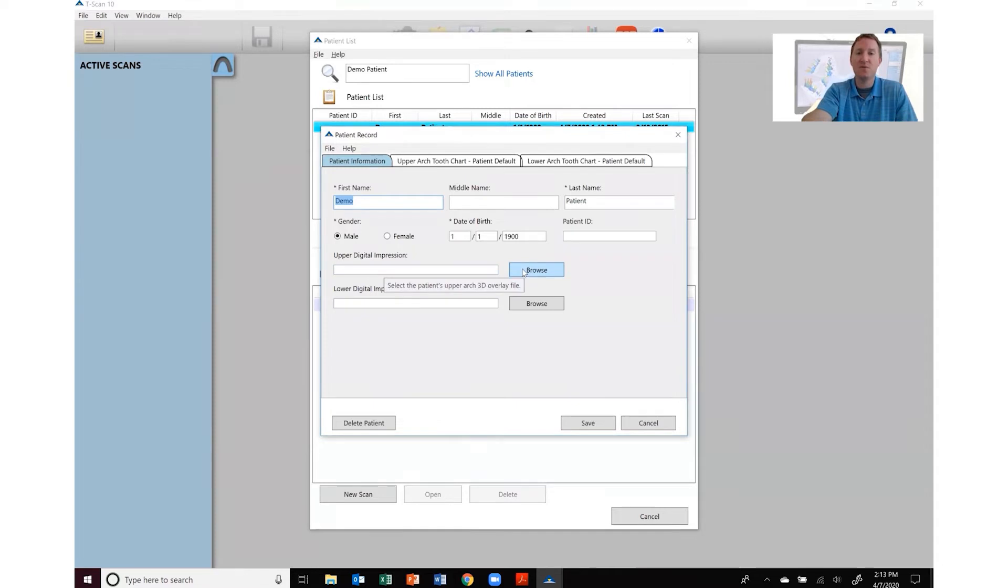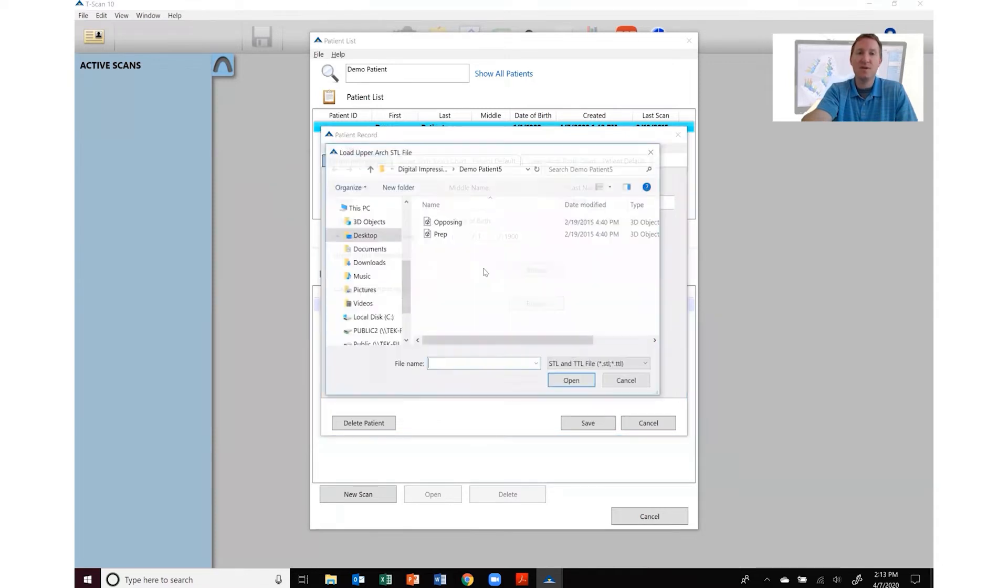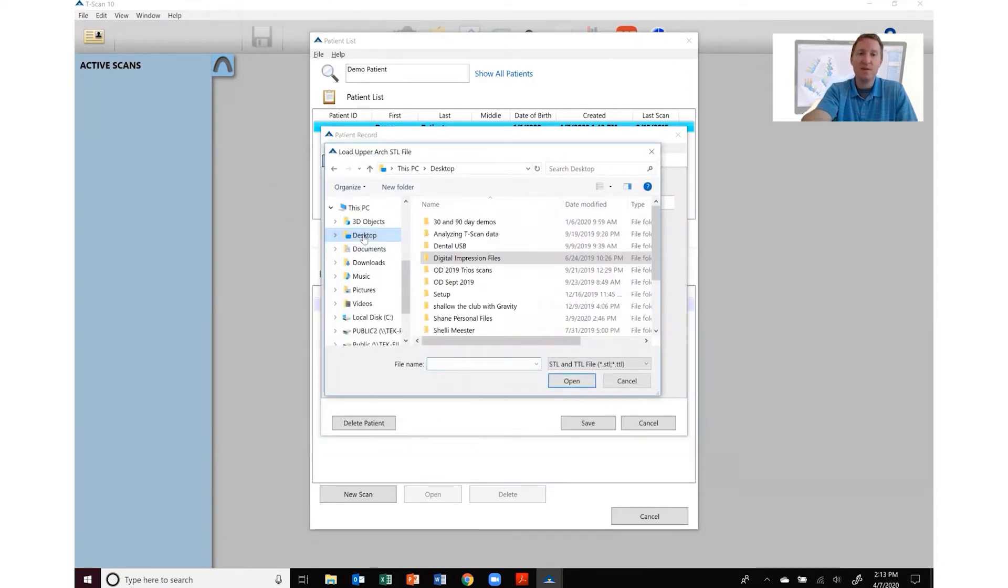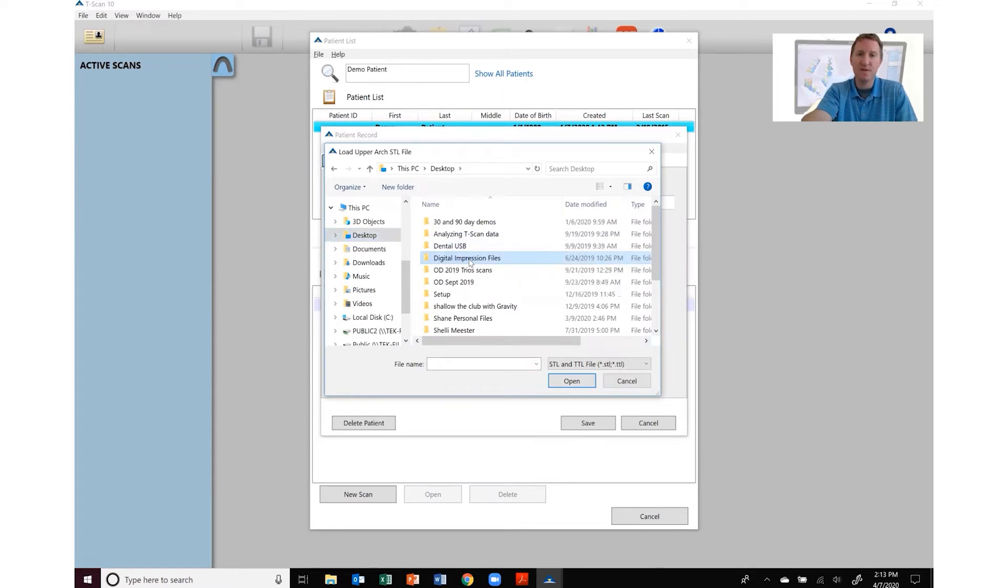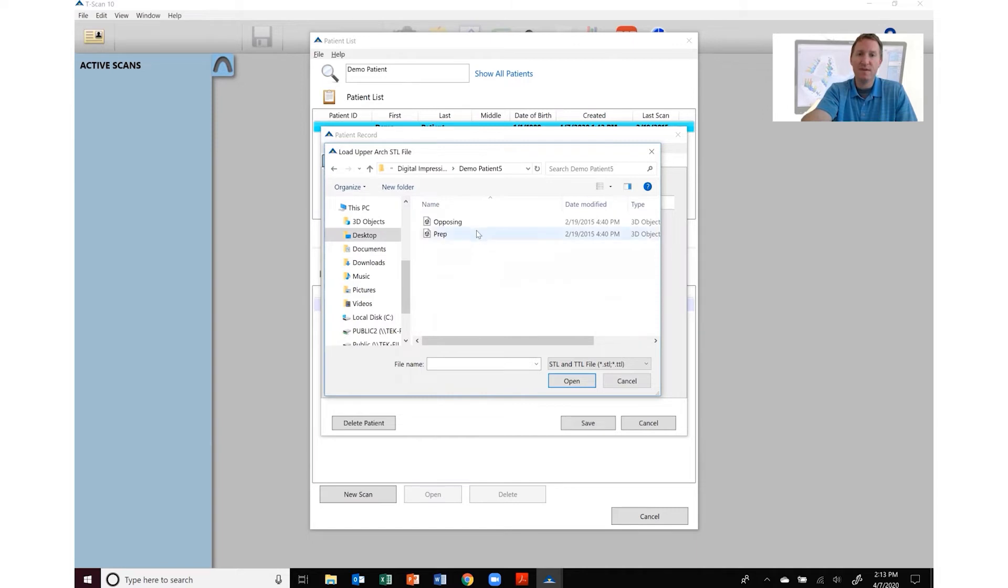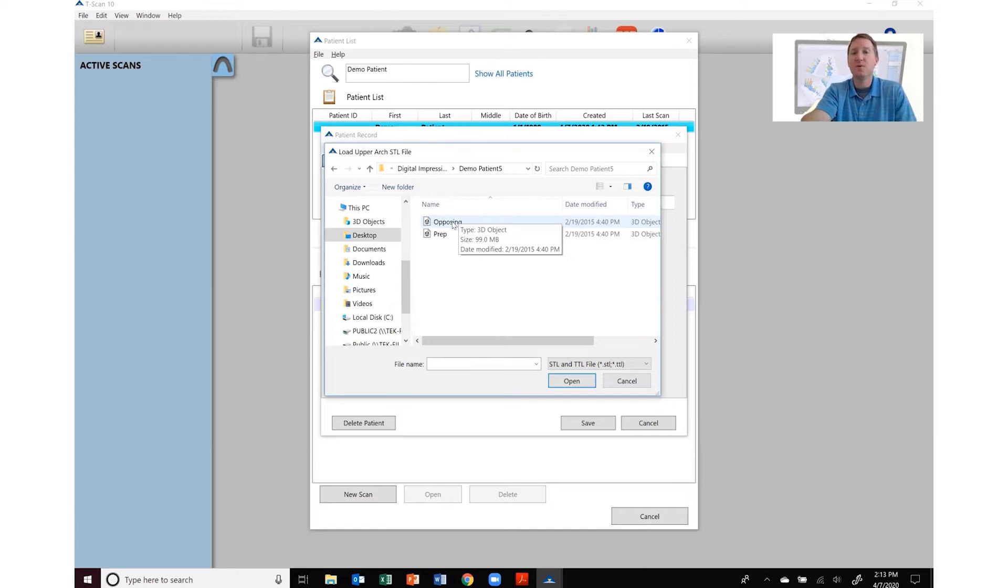We're going to click browse and then locate those files. In this case we're looking at the digital impression files. Let's do demo patient 5. The upper is called opposing. The upper or lower may be called different things depending on which system you're using.